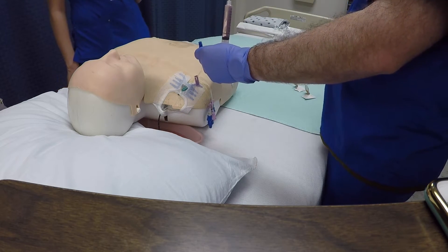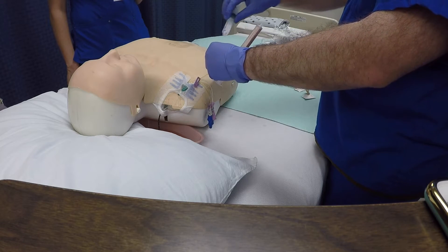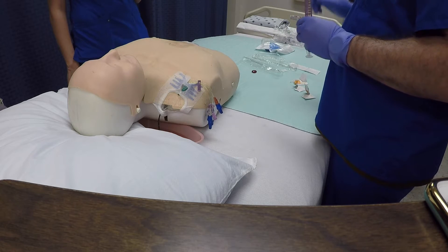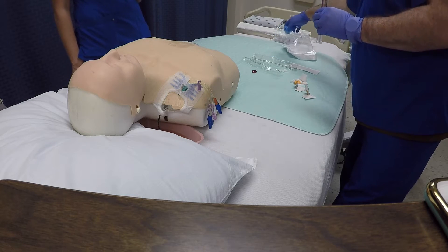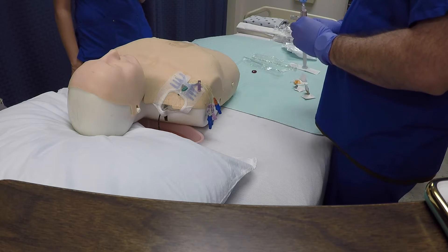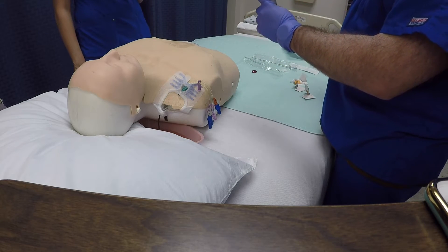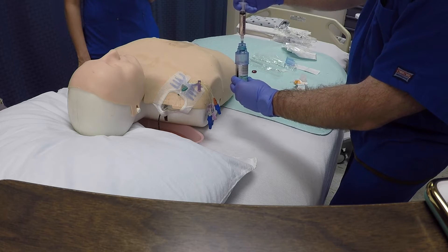Key point number two is to flush with ten cc's of saline, and the reason for that is to clear the line. Important step number five is to fill the bottles. Key point number one is to connect the syringe to the transfer device in order to transfer the blood to the bottles. Key point number two is the green bottle first, because you don't want any air in the purple bottle. Key point number three is five milliliters in each bottle, because that is the recommended amount.